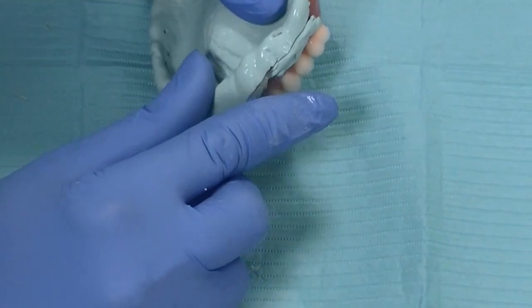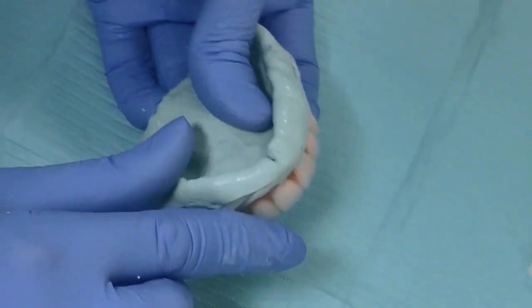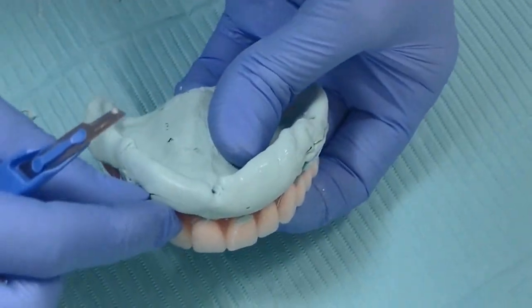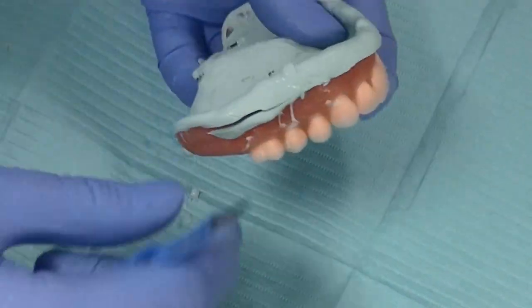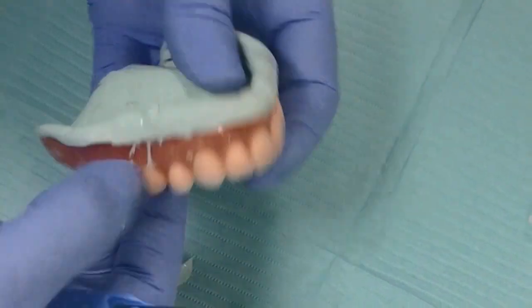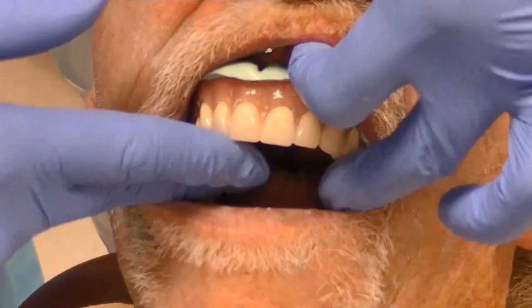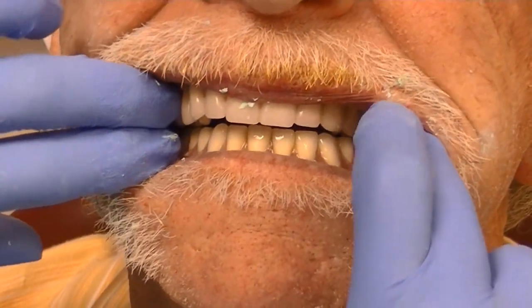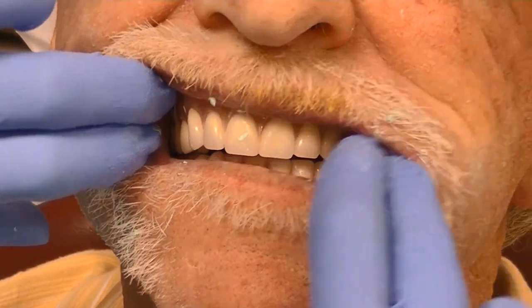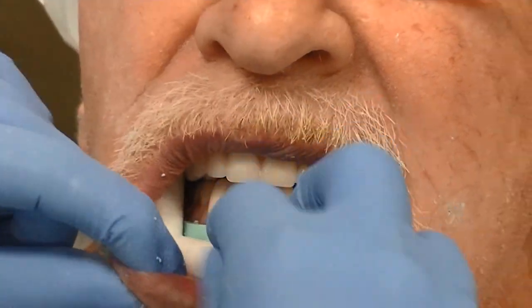Taking that same 15 blade and holding it at a perpendicular angle ensures that we have trimmed this material properly. The goal is we just don't want any of that impression material to be over the occlusal surfaces of the dentition. If it's not exactly even or perfect, that actually helps us with the clinical procedure. After completely trimming, we replace the maxillary arch back into the patient's edentulous ridge and verify everything is correct. Ensuring that the patient properly closes into a centric position verifies that we've done this at the correct vertical dimension and CR or CO position.